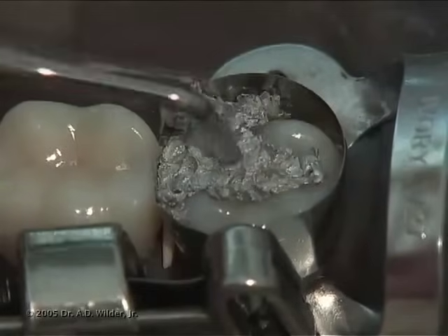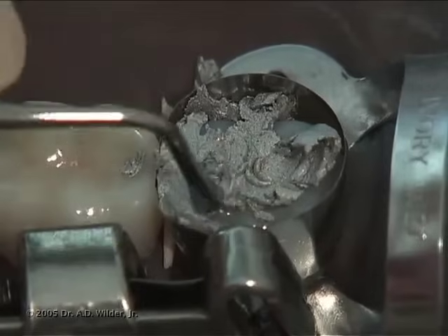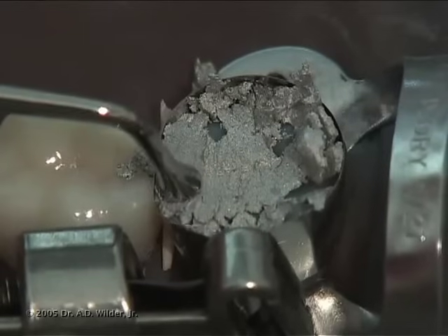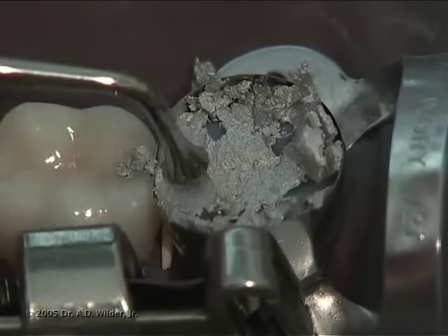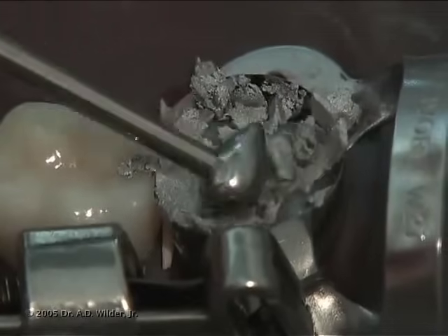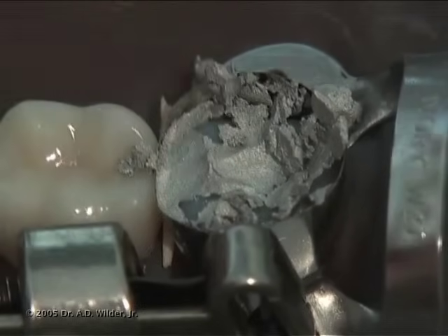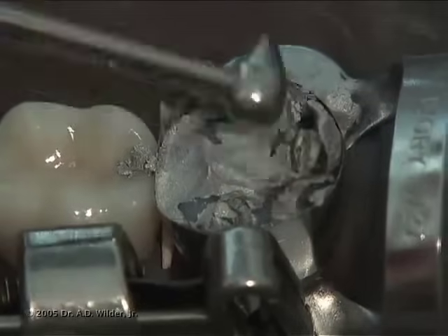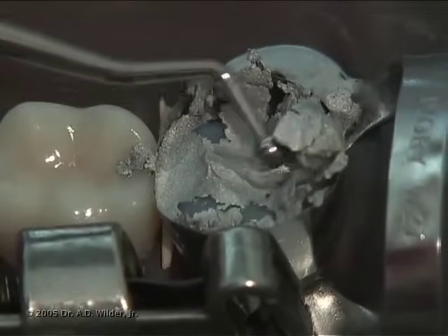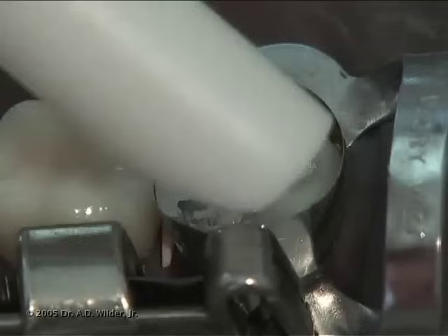You can overfill the preparation with another batch of amalgam to ensure that there will be no shortage of material and to ensure that there will be no ledge between the amalgam and natural tooth after condensation is completed. With a ball burnisher, you can pre-carve or smooth the surface while simultaneously condensing and removing excess. This helps to form a more cohesive mass while the amalgam is still in a softer stage. Use a high-volume suction device to remove any excess.